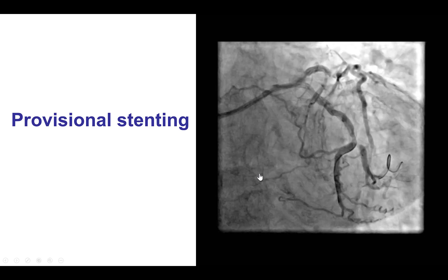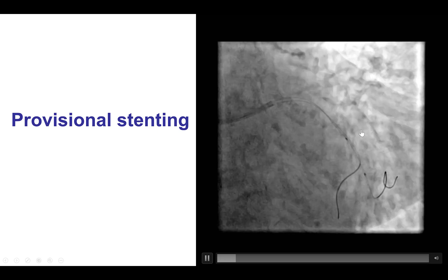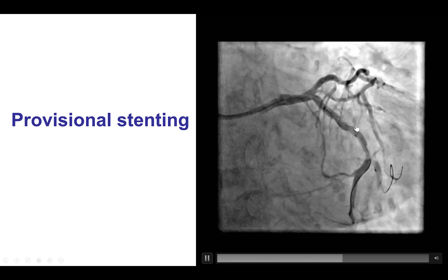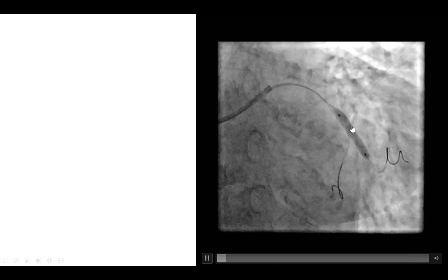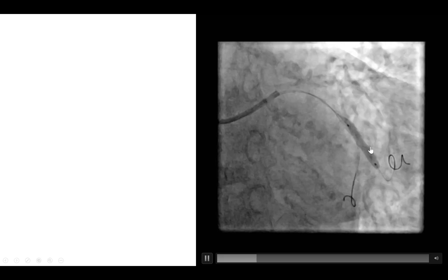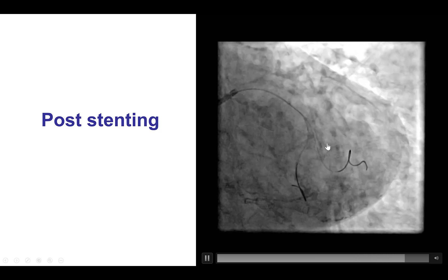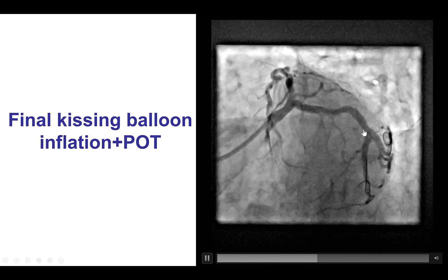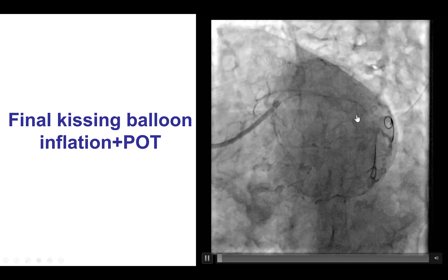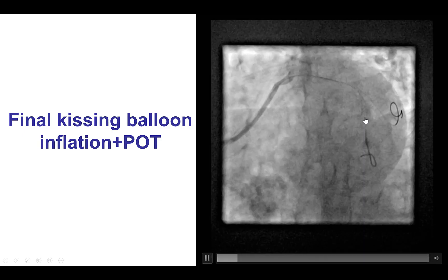We decided to treat the circumflex and the LAD lesions, starting with the circumflex. We wired both branches and decided to do this bifurcation with a provisional approach. We dilated and placed the stent into the larger superior branch in the obtuse marginal. There was some pinching of the distal circumflex, which is why the distal circumflex was rewired. Kissing balloon inflation was performed as well as the proximal optimization technique, and that provided a very nice result in the circumflex.